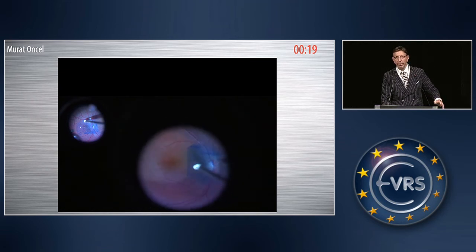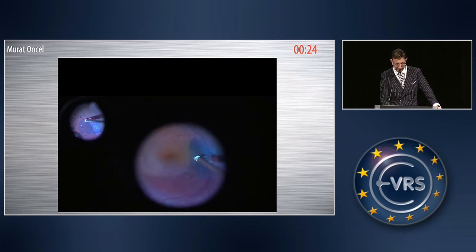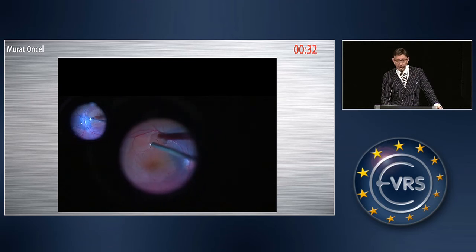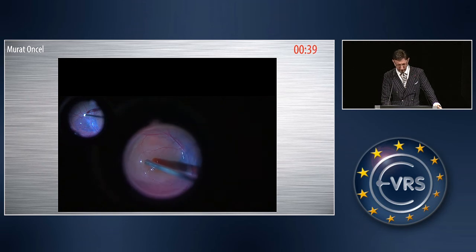I injected approximately one cc of liquid perfluorocarbon to keep the ILM flap in place. Then I did the air-fluid exchange. After the air-fluid exchange, I injected Densurone Extra — it's a heavy silicone oil that can be injected through a 25- or 27-gauge needle. It is a different heavy silicone oil.